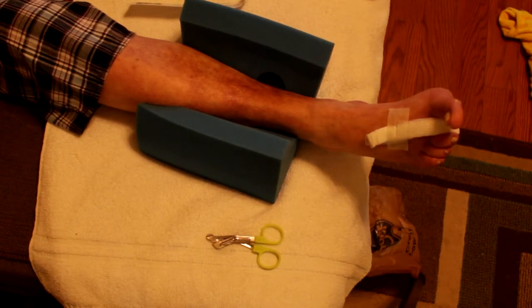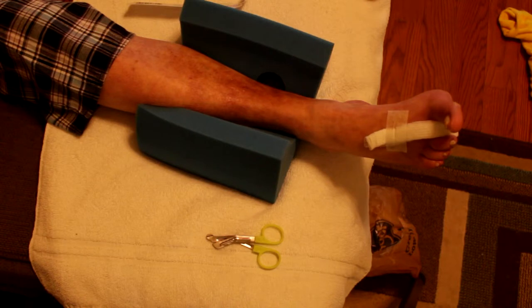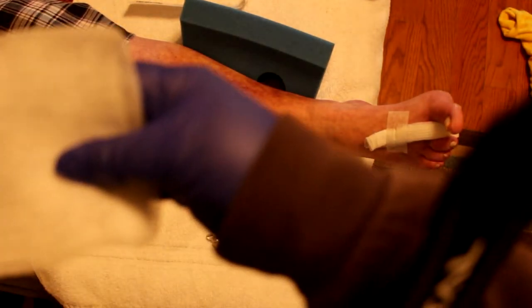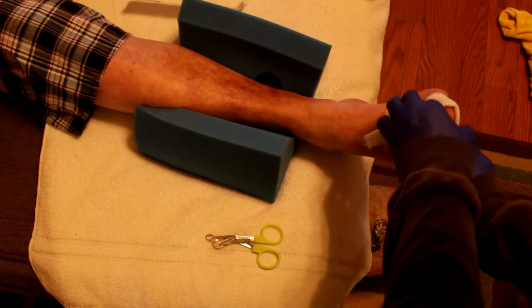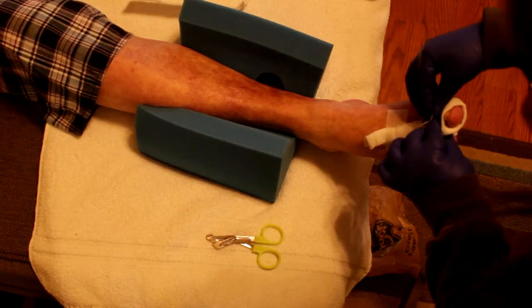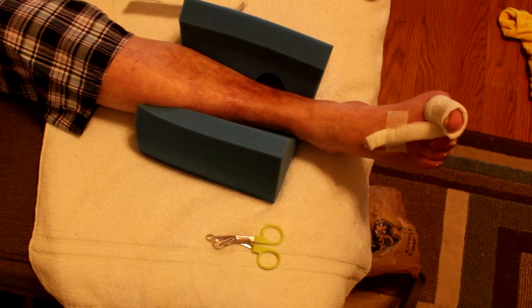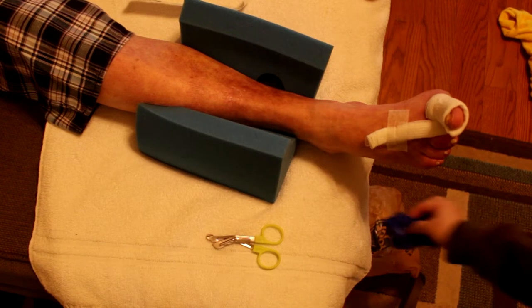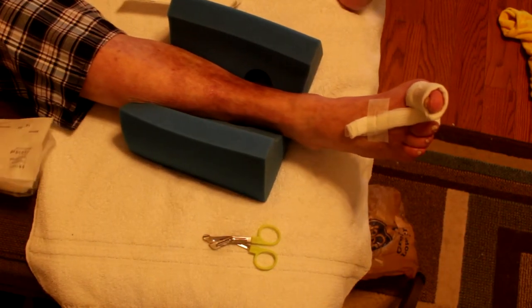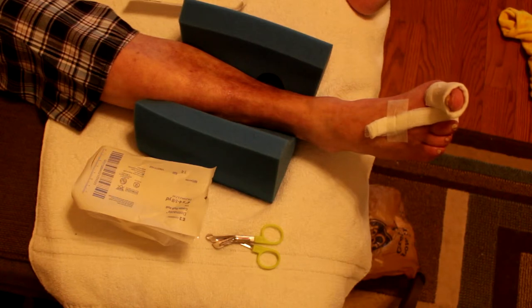Okay, I have to wrap the toe with sterile gauze. I fold the gauze in half and put it on the toe, then stick it in place with tape to get it to stay. At this point I take off the gloves — and you can see how sweaty my hands are, they are dripping in sweat from these gloves. This happens to everyone — this happens to nurses. The little thing you didn't know when people are taking care of you in hospitals is that their hands are sweating.